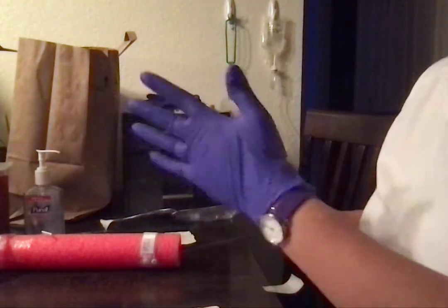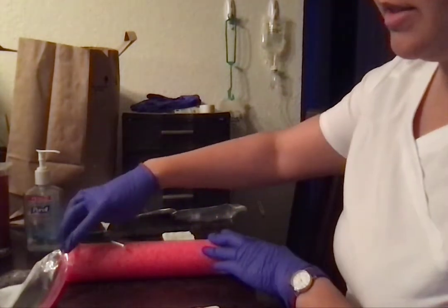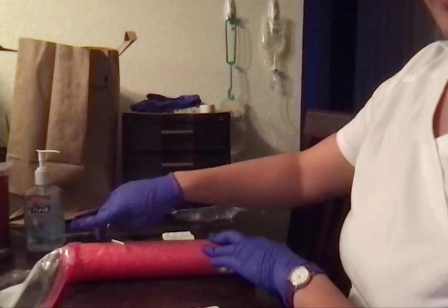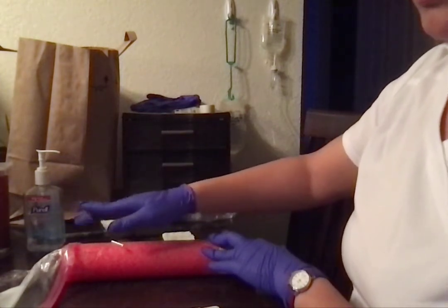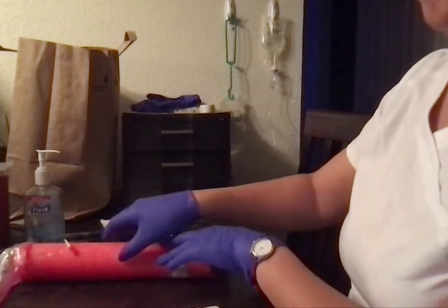All right, Millie, I'm just going to assess your arm real quick, if that's okay. I'm going to assess the arm, make sure that there's no redness, swelling, discomfort. Millie, do you feel all right? Yes. Is there any pain? No. Okay, wonderful. So it's not hot to the touch. It feels good. Happy with that.